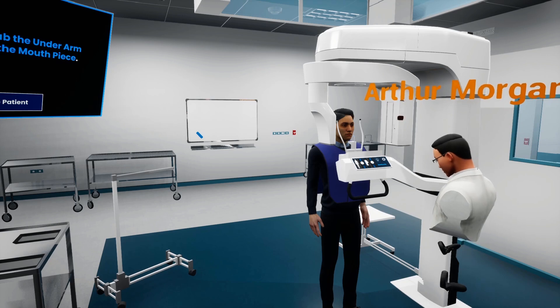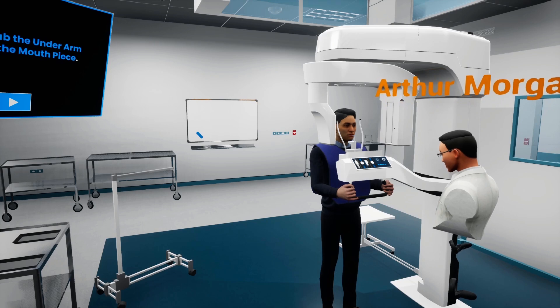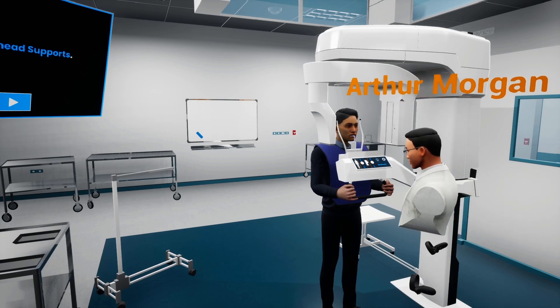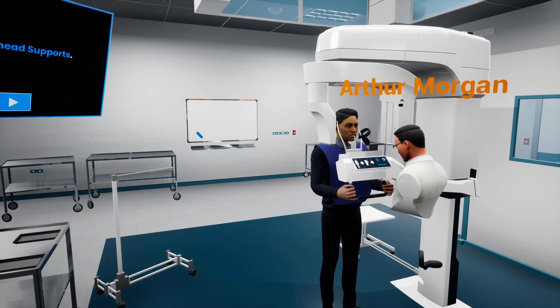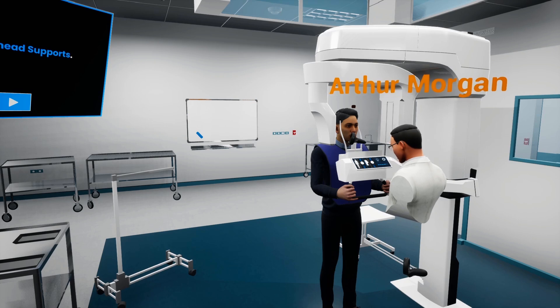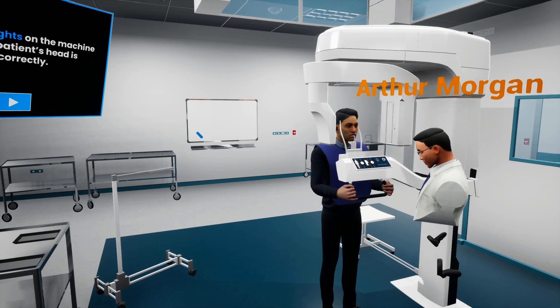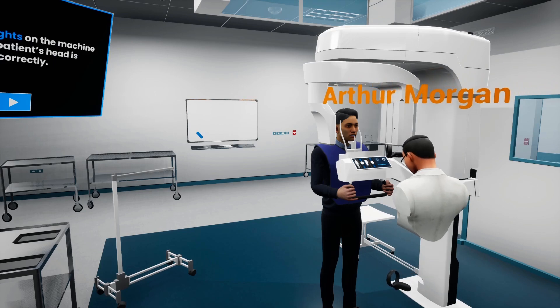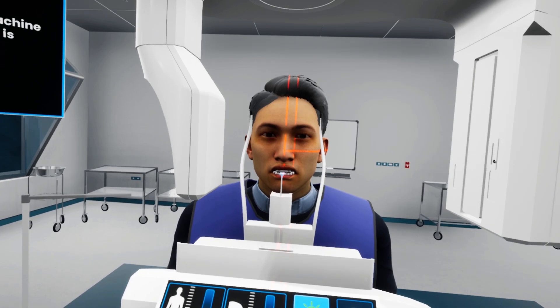This looks good for now, so we can ask the patient to grab the handle beneath the headrest and to bite down on the mouthpiece, and to ask specifically for the patient to lock his teeth on the small indentation in the mouthpiece. Now we need to tighten the forehead supports, which would assist the patient in remaining still while taking the panoramic image. The next step is to turn on the guiding light by toggling on the light button on the machine's panel.